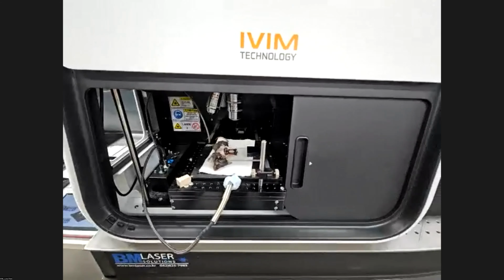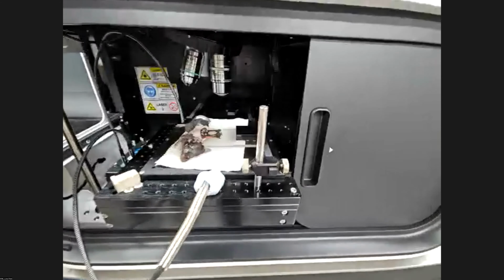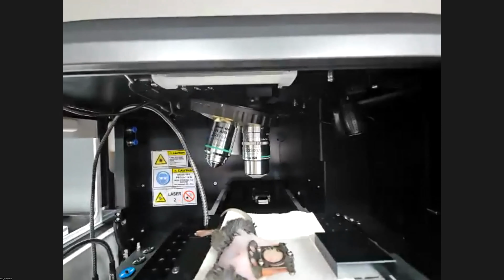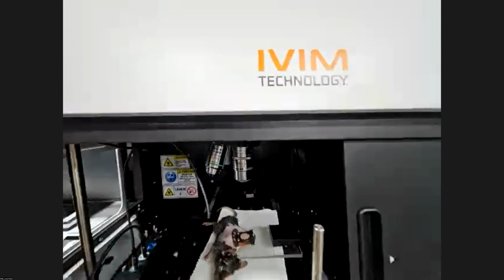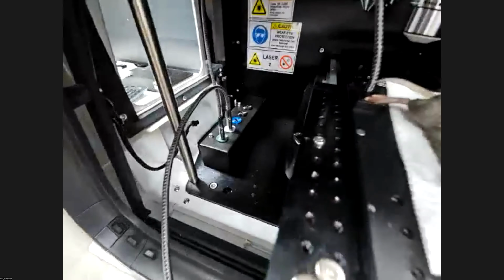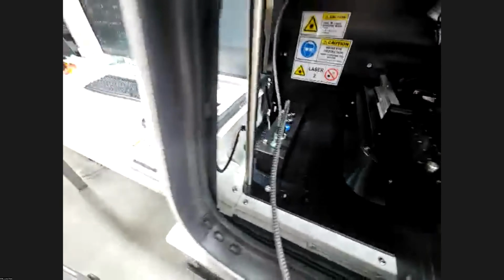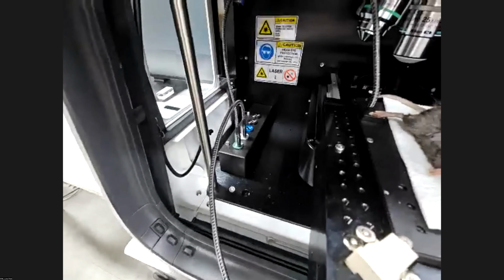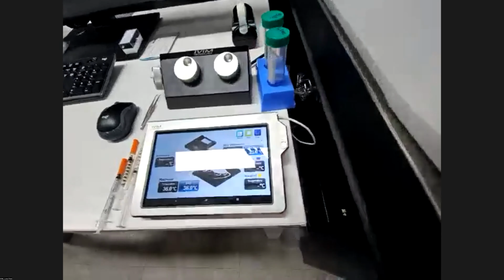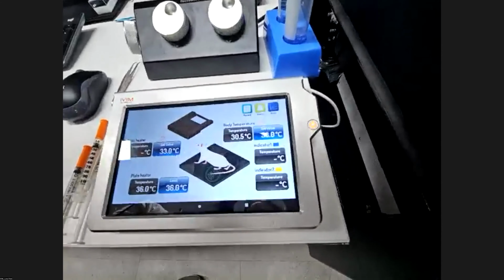In this imaging room, an automatically rotating turret for 5 objective lenses is furnished on the ceiling. And underneath, there is a stage controller controlled by a jog dial. And we can see the 5 connectors already attached to the rectal probe and the preheater.